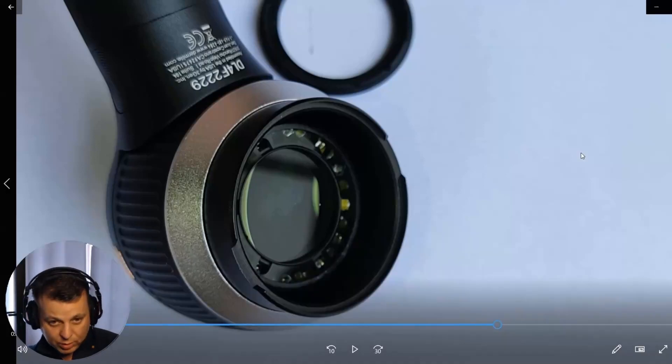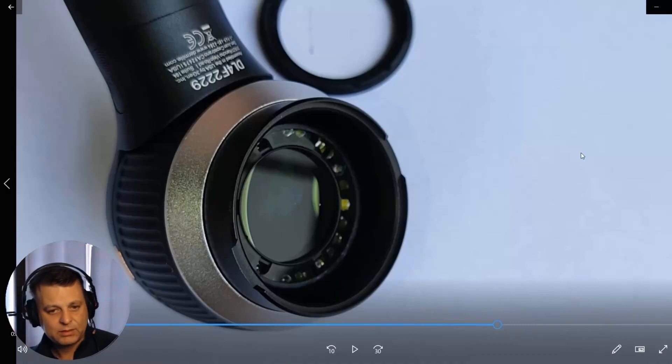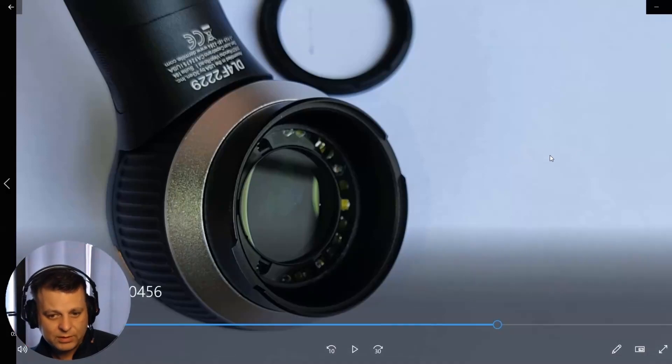But at least when you remove it, it will remove any cracked glass from obscuring your view within the dermatoscope.